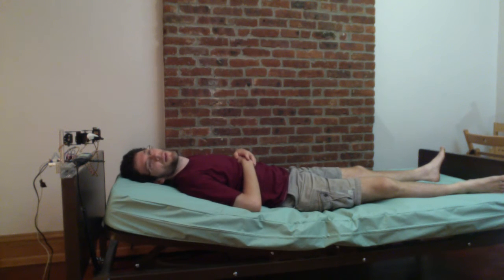Alexa, turn on head raise four. Okay. Alexa, turn on head raise three. Okay.